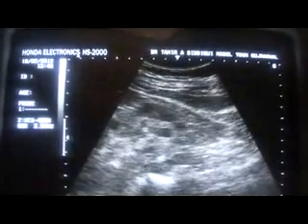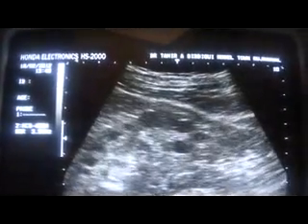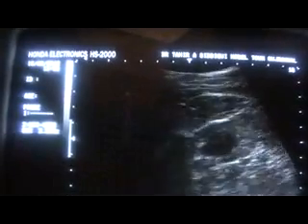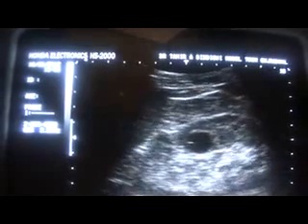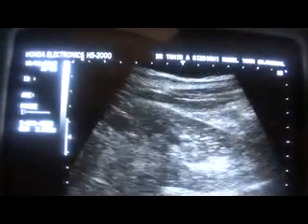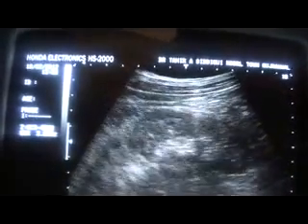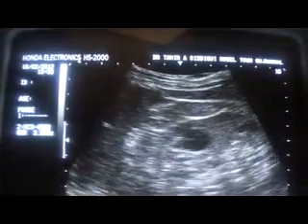This is an adult polycystic kidney. You can see there are uncountable cysts in this kidney. This kidney contains more cysts as compared to the right kidney. Upper pole, mid region, lower pole, seen at all regions.